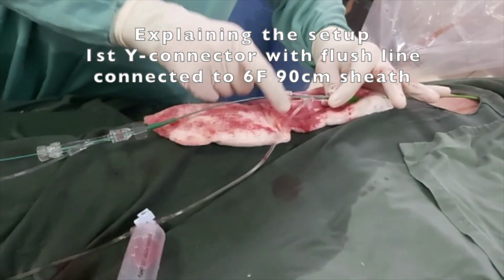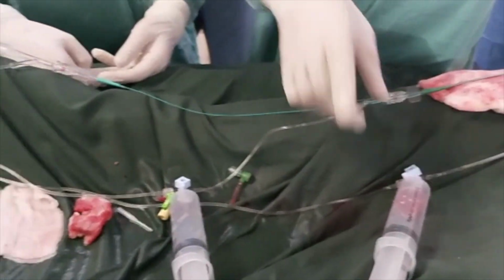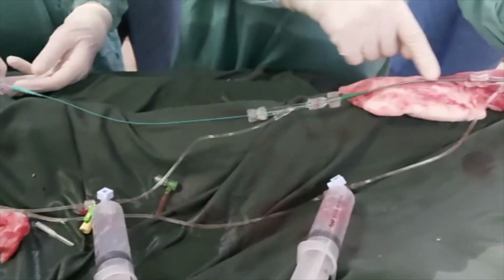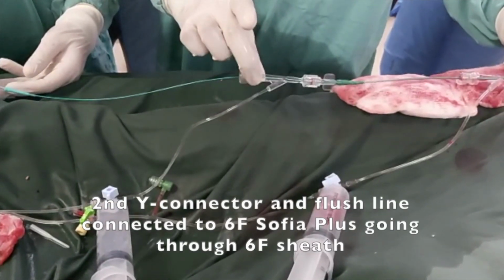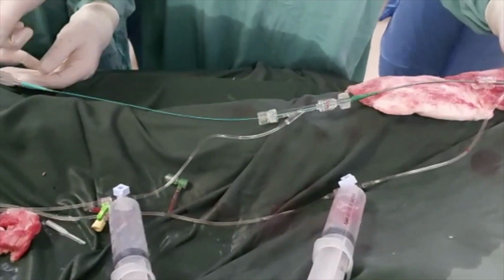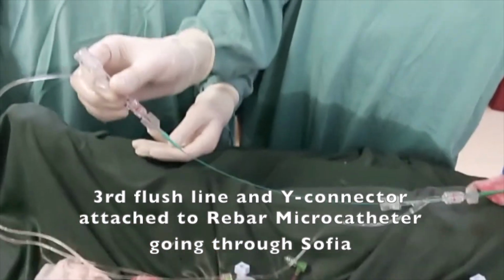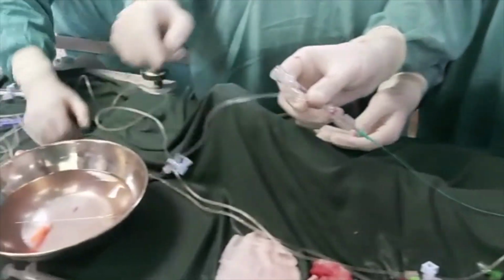So 6 French destination sheath connected to a Y connector, which is again connected to a flush line which is continuously flushing. Then I've got a Sophia Plus in, which again has a Y connector and a second flush line, again with a continuous flush going on. Then I have a Rebar microcatheter which is again connected to a flush line through a Y connector.